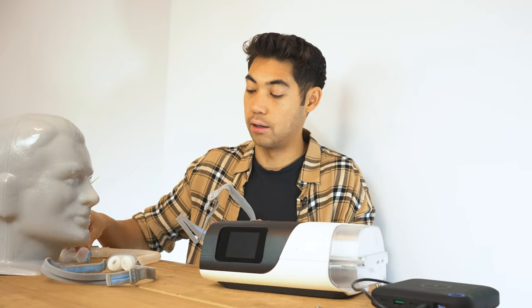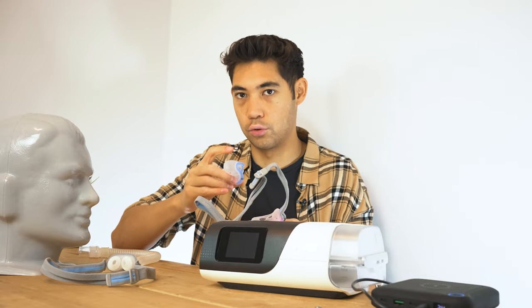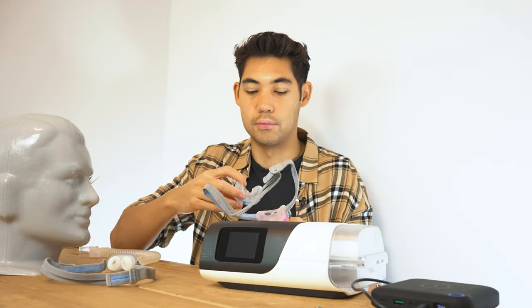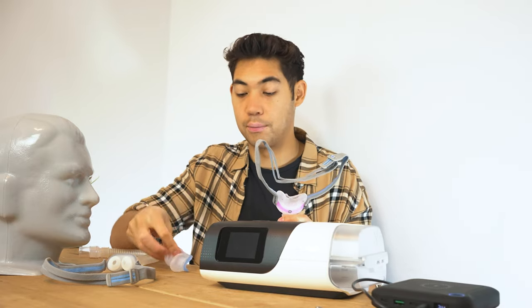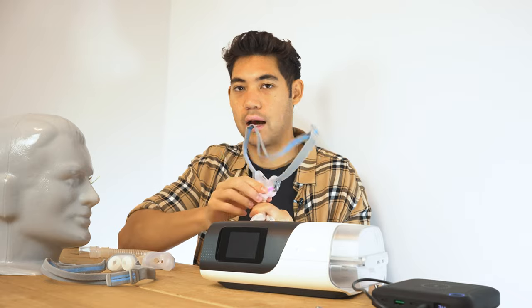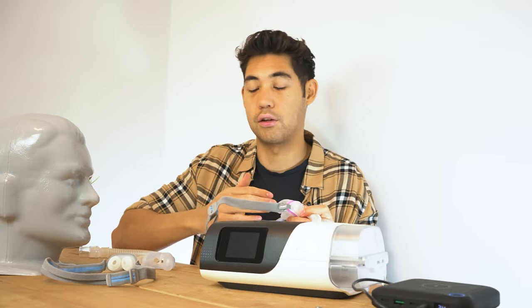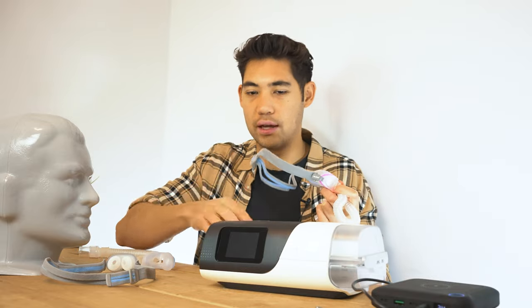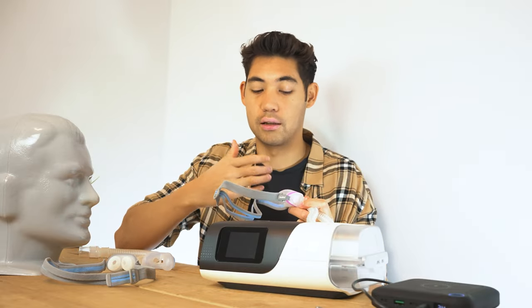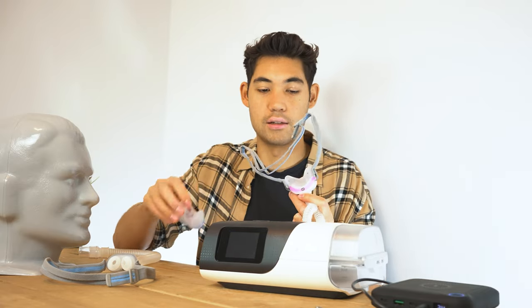One thing to note is that cushion size is very important. I found that with this mask you've got to make sure you're using the correct cushion size. I use the small wide because I have a very squishy, flatter, small nose. When I put on the medium or standard shape, it doesn't work at all — but with the small wide, the mask improves drastically. So make sure when you get an N30, even if you think you're a small or a medium, try them all on with the machine running and see what leaks the least, because it's a pretty dramatic difference between the sizes.